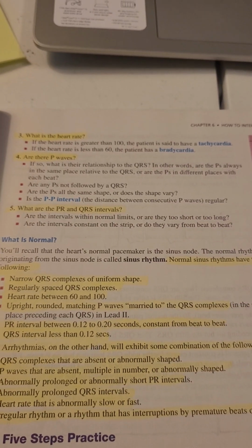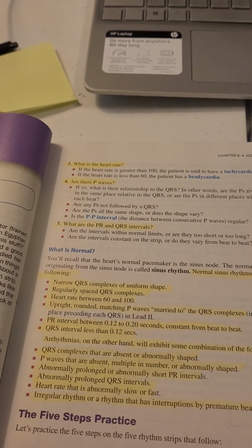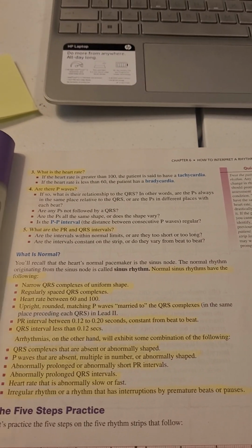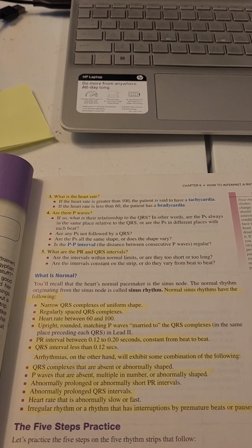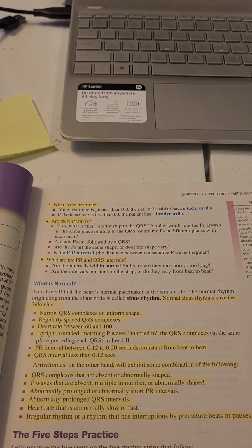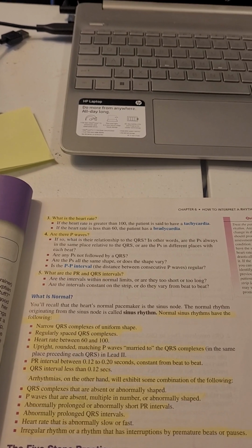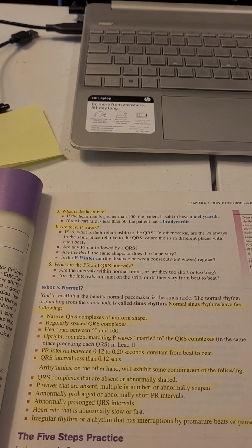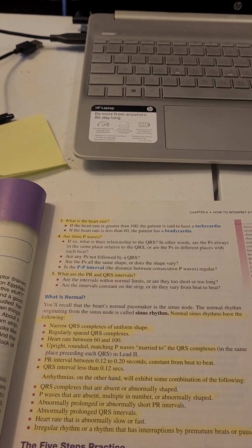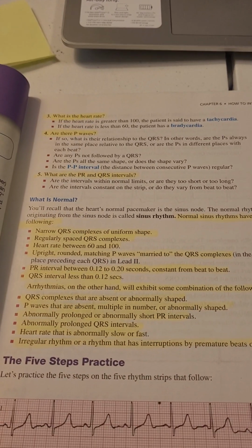Arrhythmias, on the other hand, will exhibit some combination of the following. Arrhythmias means abnormal rhythms. QRS complexes that are absent or abnormally shaped. P waves that are absent, or multiple. If you have a lot of P waves, or they're not in the same place, running around all types of places before the QRS, then that's a problem.